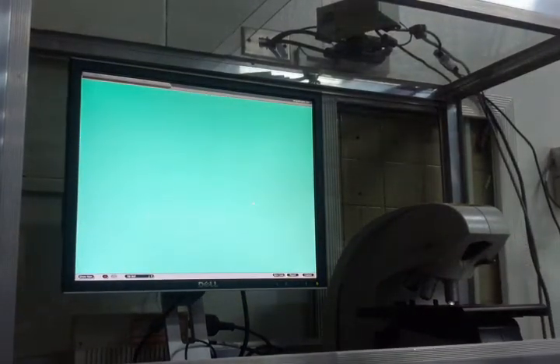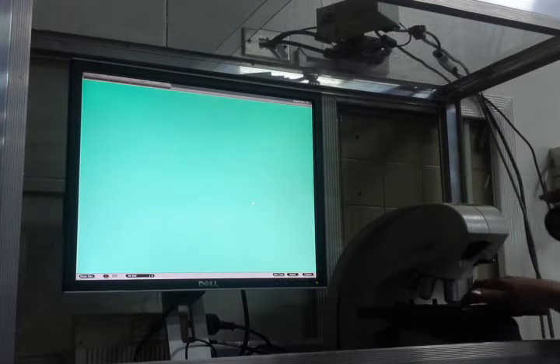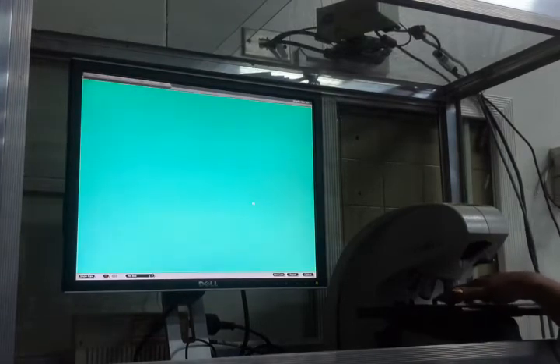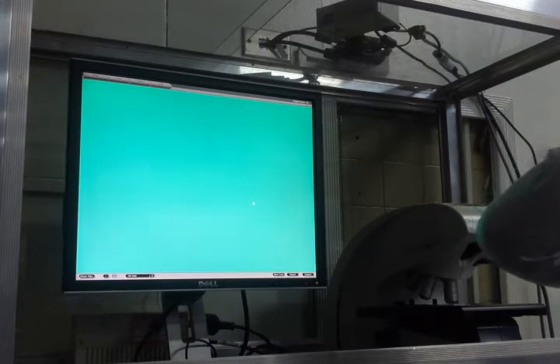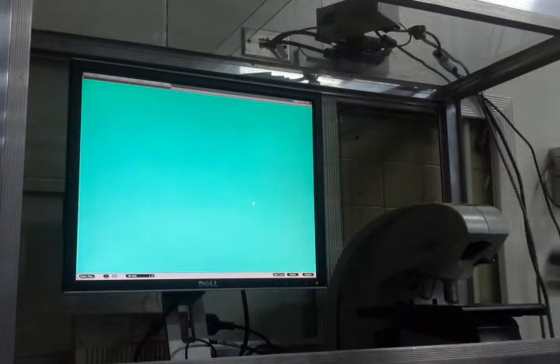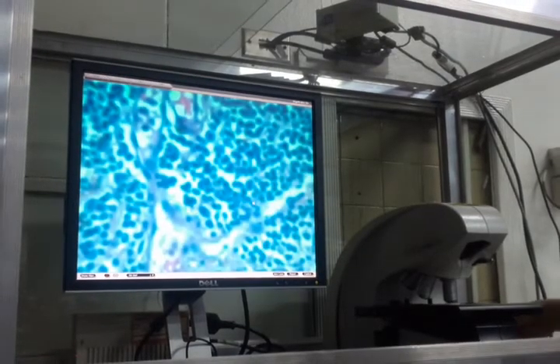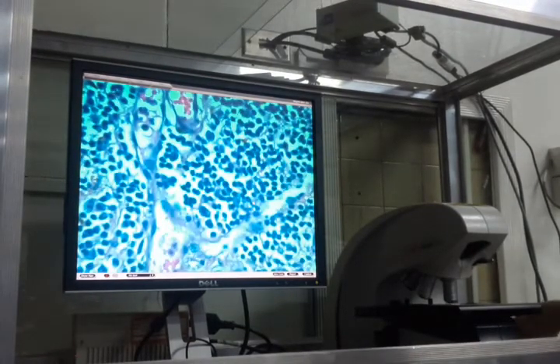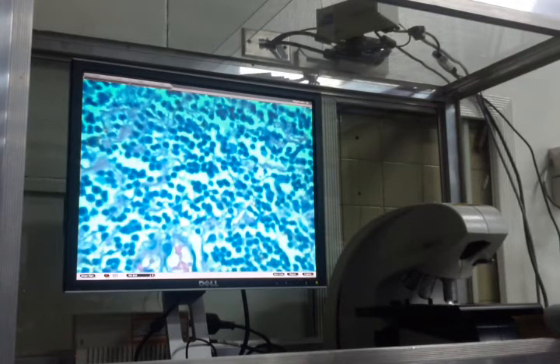You must recognize the inclusion body. Pagka black, carbon yon. Pag yellow, brown, na gano'n ang kulay, pwedeng hemosiderin o kaya pwedeng melanin, depending on where you see it. Bilirubin din, pwedeng gano'n yung kulay. Kasi hindi mo naman siya makikita as green. Hematoxylin and eosin lang yung stain mo.